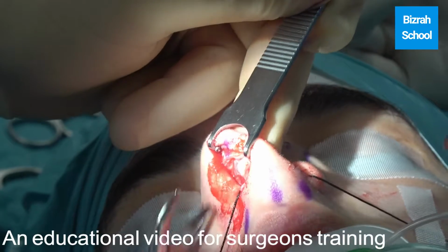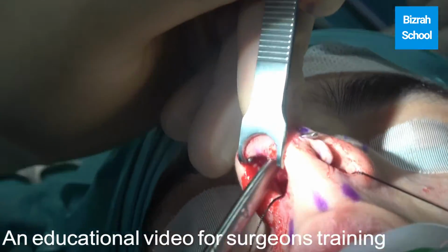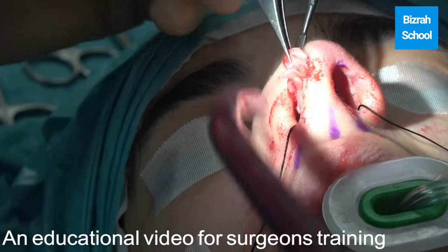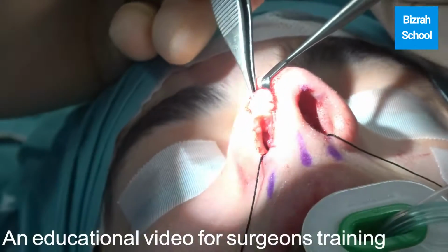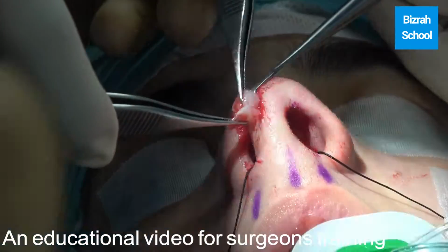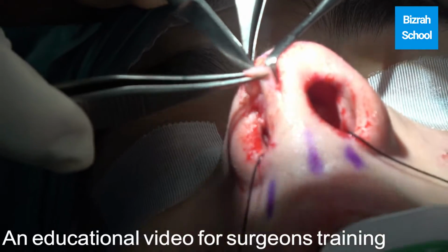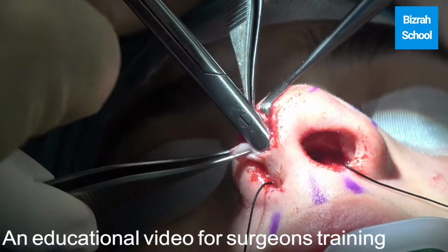Yeah, the patient has got very tiny, small cartilage, very tiny intermediate crura. So we're getting the two intermediate crura to one side now, and then we'll make a pocket in between the two medial crura, just above the nasal spine.